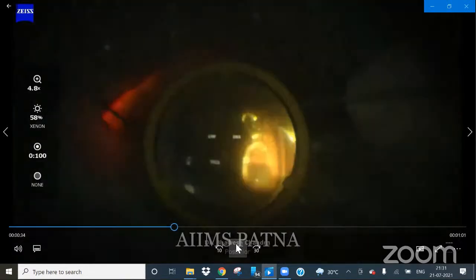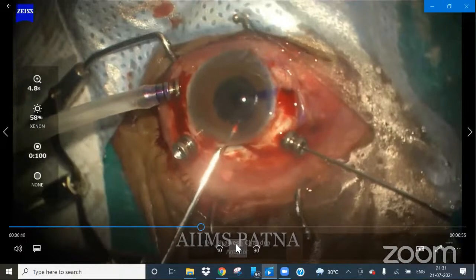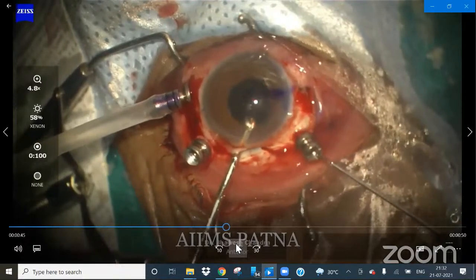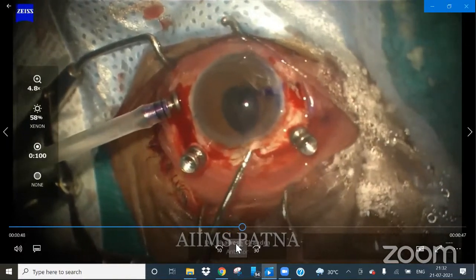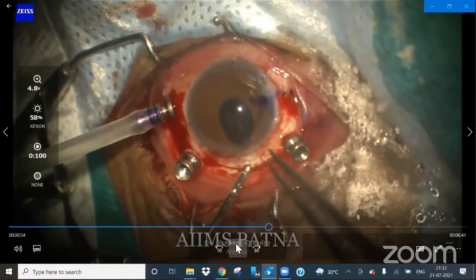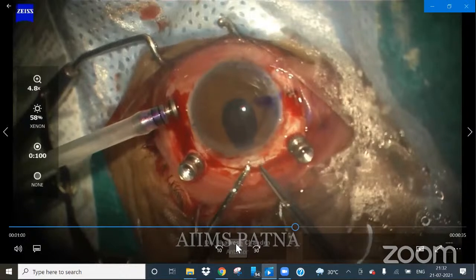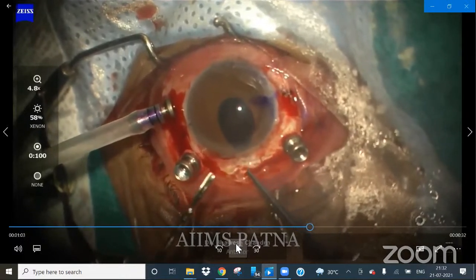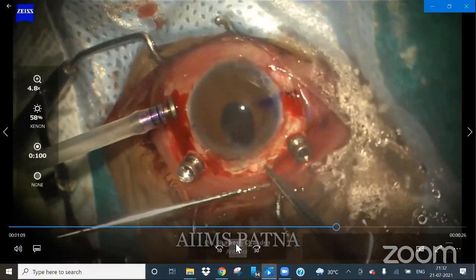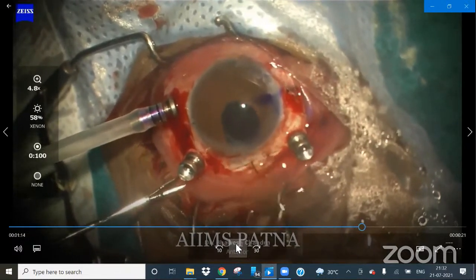You can see this. I'm trying to maneuver it. So once I have brought it over the pupillary plane, I have introduced a second forceps, and through handshake technique, I transferred it to the other forceps. A preformed tunnel has already been made. Since it was a foldable IOL, through minor adjustments, I brought it in the AC. A foldable IOL doesn't require much effort if the pupil is well dilated. And then through sequential pulling by forceps and through a small tunnel only, I could explant it.